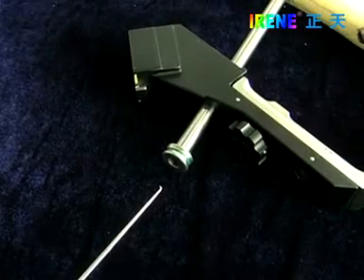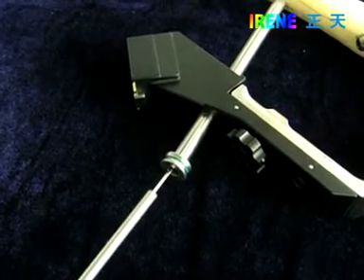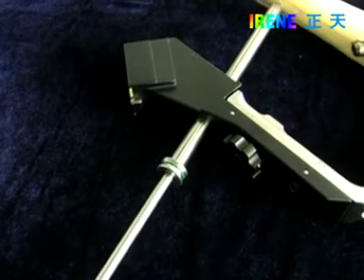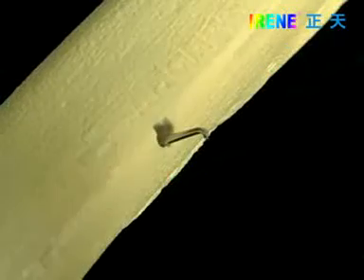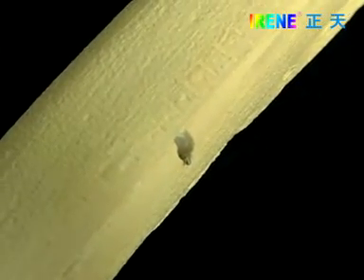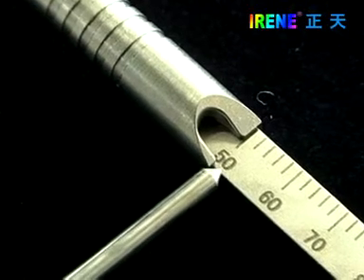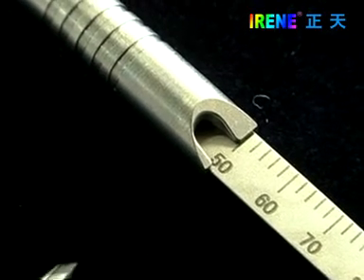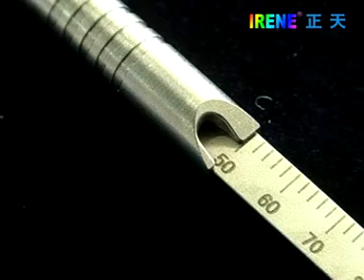Take out the drill sleeve, insert the depth gauge until the tip grasps the far cortex. The number shown on the gauge should add 2 to 4 millimeters, the result then being the length of the locking screw that will be used. Here the number is 50, so we use a 52 millimeter locking screw.